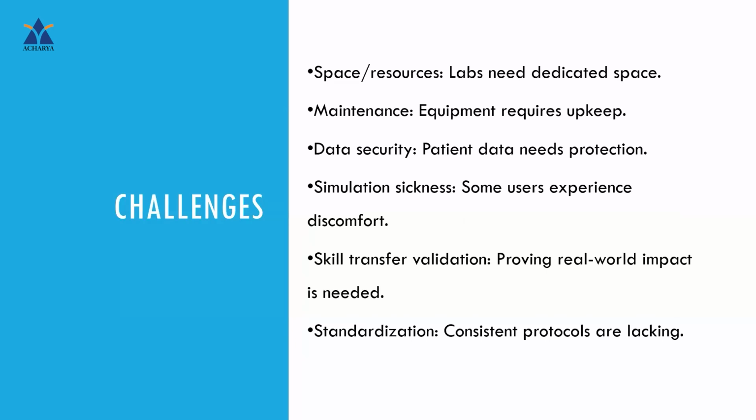Simulation sickness, some users might experience certain discomfort when they're using all these virtual reality systems. So if they are using these head mounted displays, there are chances they might find it uncomfortable.